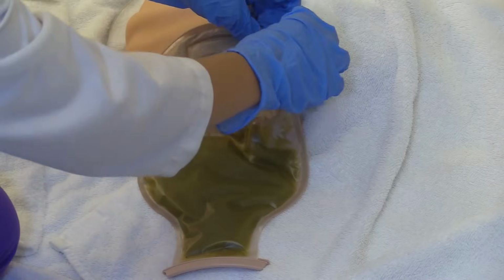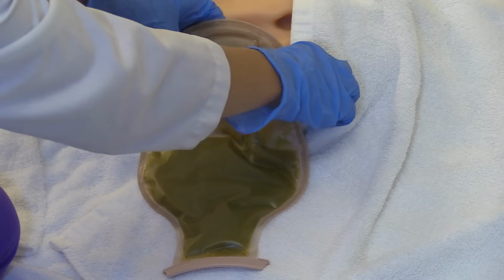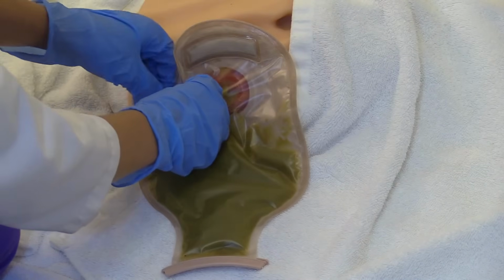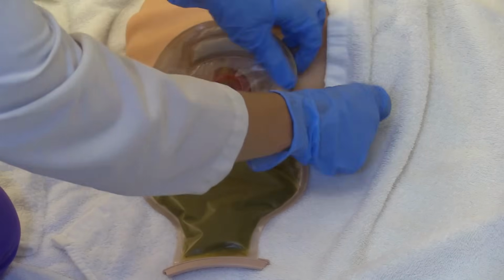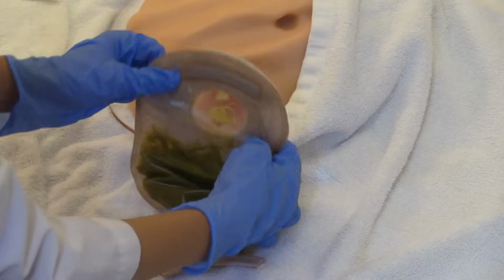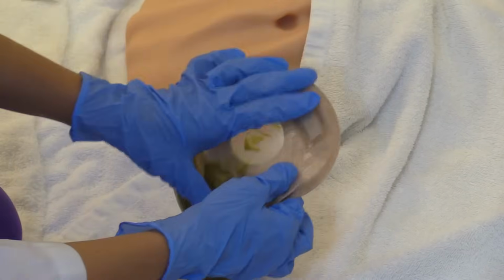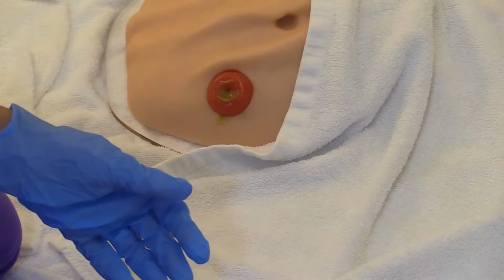What you're going to do is gently remove the adhesive, because this is the one-piece system and it's sticking to the skin. If you have difficulty removing it, you can use some adhesive remover. Okay, so we have that off. And you're just going to discard this appropriately.